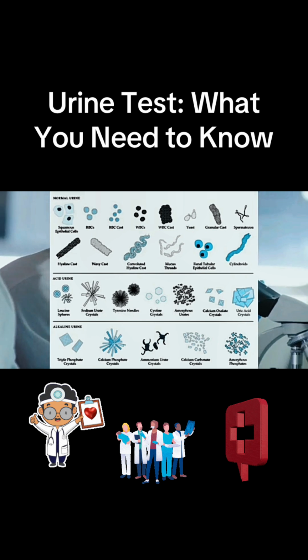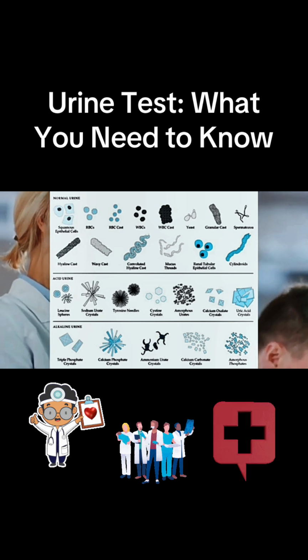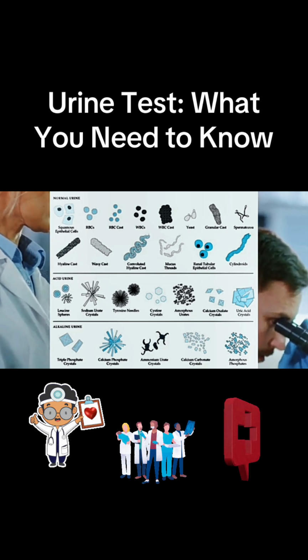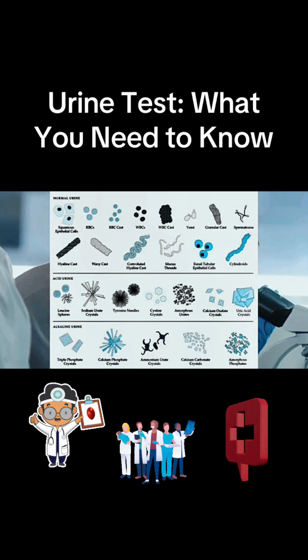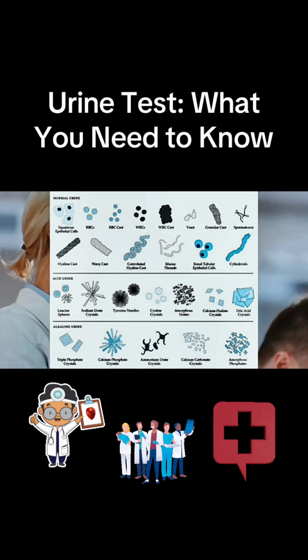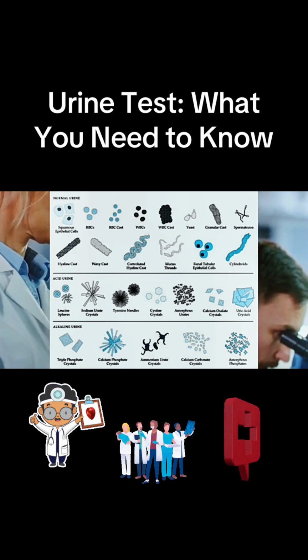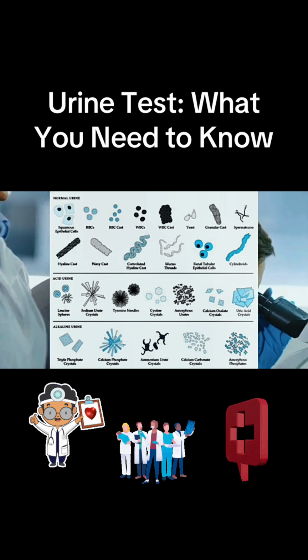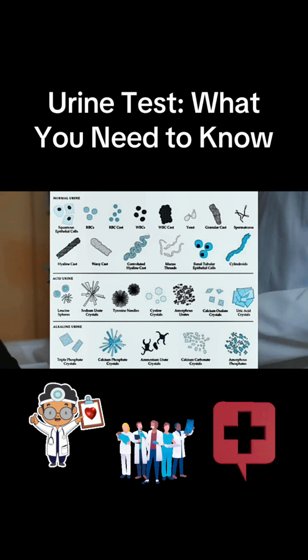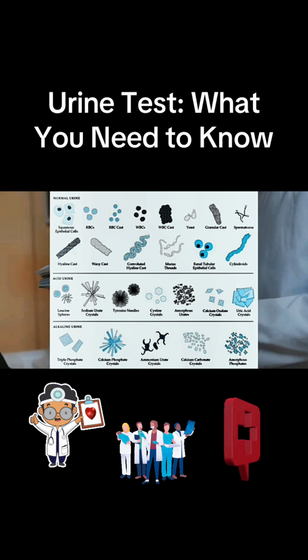Urine microscopic findings. A lab technician may examine a urine sample under a microscope to look for tiny substances in the urine, including cells, cell fragments, urinary casts, mucus, bacteria or other germs, crystals. Microscopic tests that providers may include in urinalysis include red blood cell, RBC, urine test. An elevated number of RBCs indicates that there's blood in your urine. However, this test can't identify where the blood is coming from.